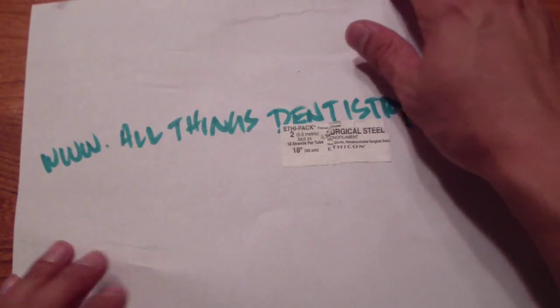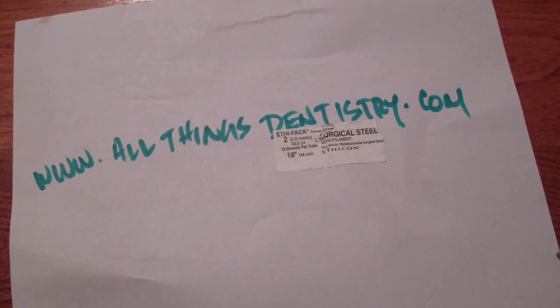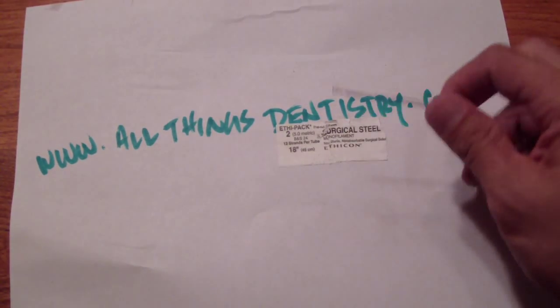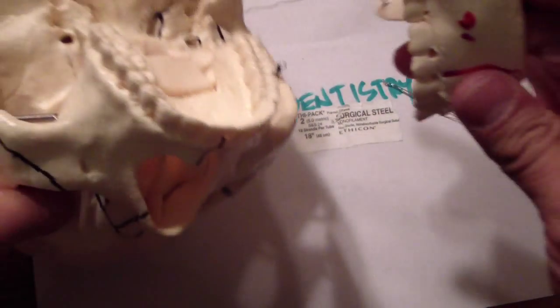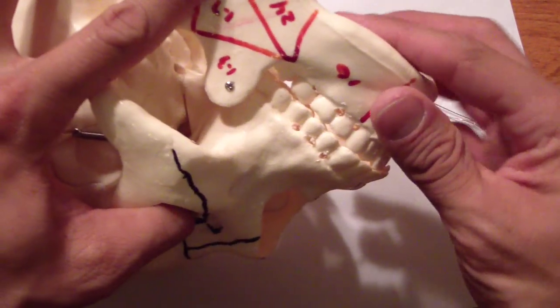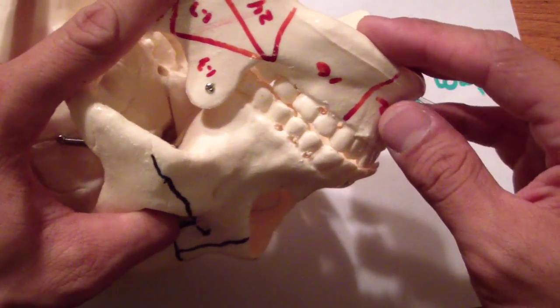Hey folks, Ashley at allthingsdentistry.com. I just want to go over how we use an Ivy loop in fixating a fractured mandible. This little friend here — and what I'm going to do is on my plastic skull, which weighs like a ton, is we're going to fixate on the left side.